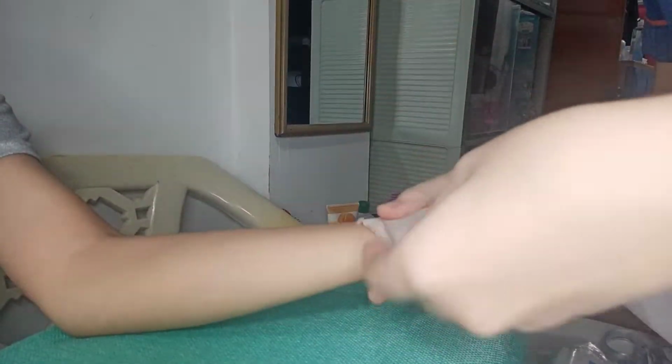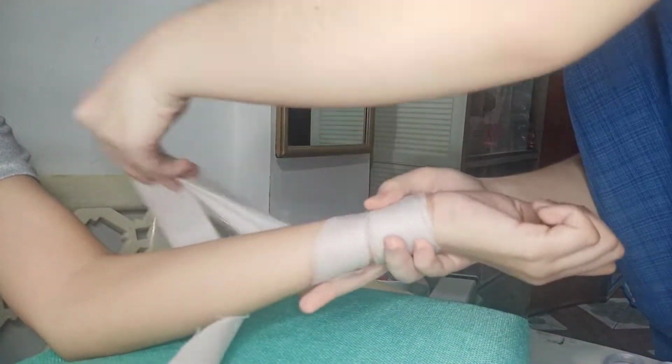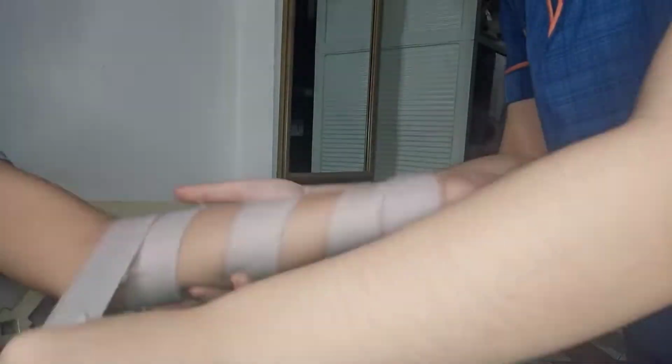Anchor the roller bandage at the wrist. Apply a series of spiral turns around the forearm, where the spaces between turns should be equal to the width of the bandage. Secure the bandage just below the elbow.